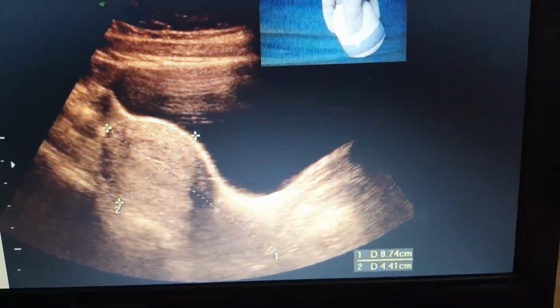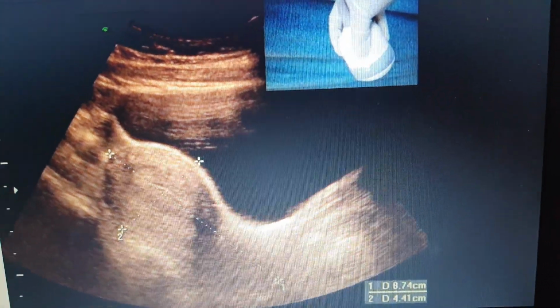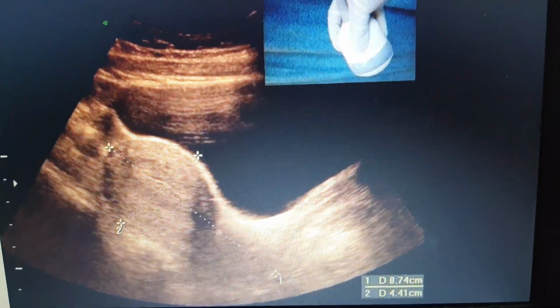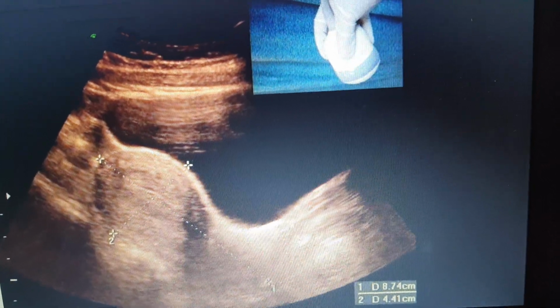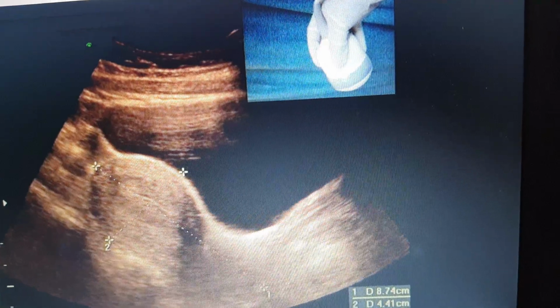If there is a site, of course, you will find this, and I'll give you many other pictures and many other videos for different entities like this. But please remember how that very simple picture appears, because knowing the normal by heart would simplify how to see the other pictures or how to see the other abnormalities later.